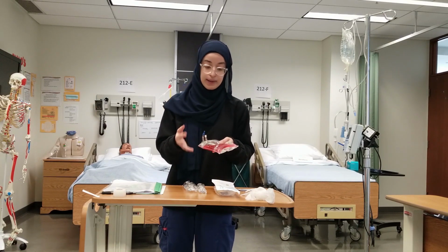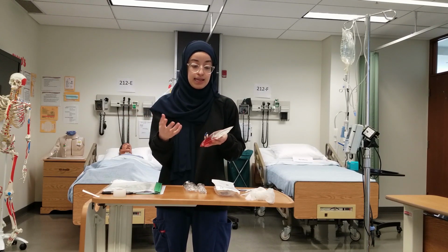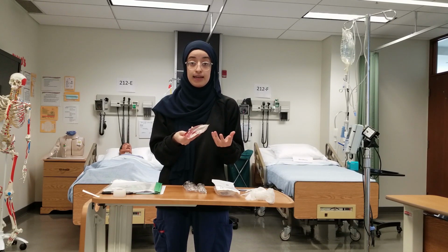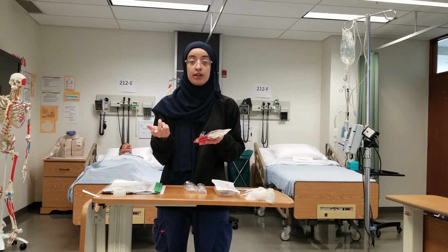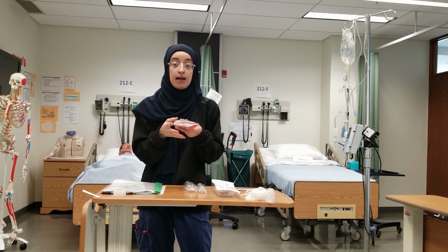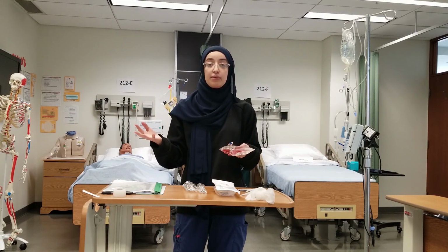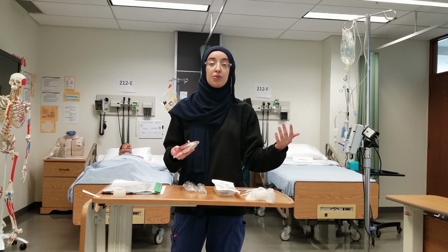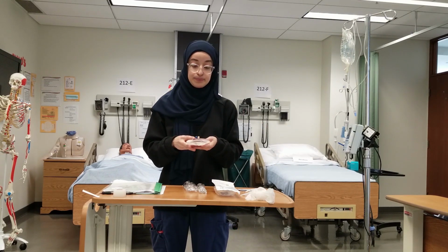When I'm at the blood bank, I would say the patient's name and their identifiers, their blood type, and then when the nurse or tech gives me the blood that I need, I'm going to go ahead and read out the numbers to her to identify that we have the same and the correct blood product that we are giving to the patient. When I get back to the floor, I also want to double check with the nurse, so independent double check. Give the blood back to the nurse along with the patient's information, and they will double check and sign off on that as well.